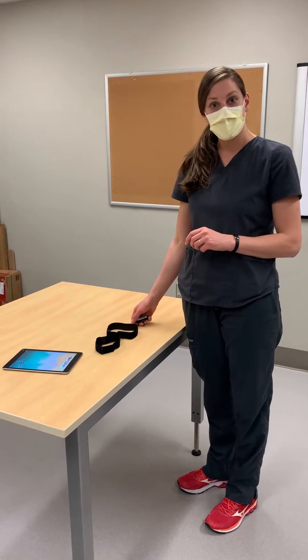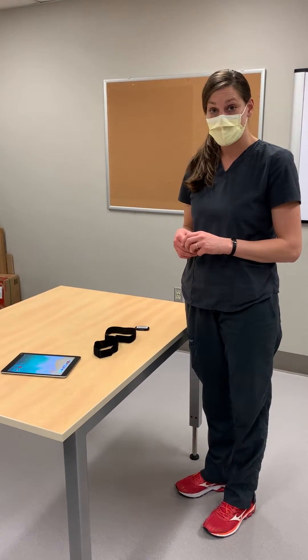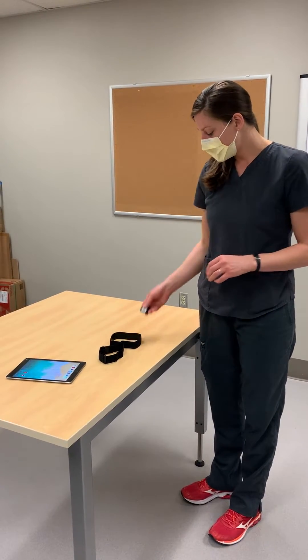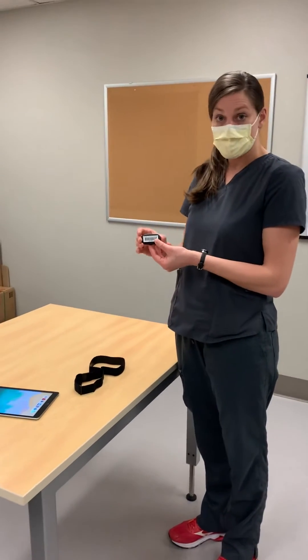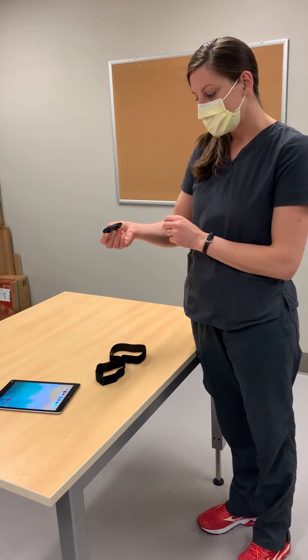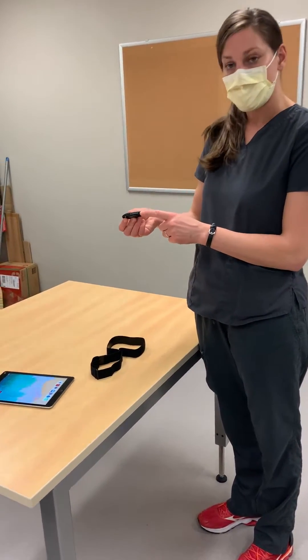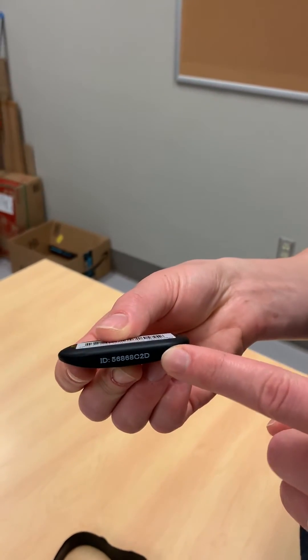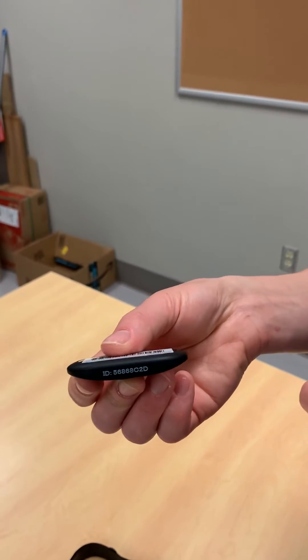In this video we're going to show you where to start when you are just setting up your polar heart rate monitor. First we have this puck — this is the actual monitor. On it we have an ID number, and this is the ID number that you'll look for when you're ensuring that your app is paired correctly with the monitor that you have on your patient.